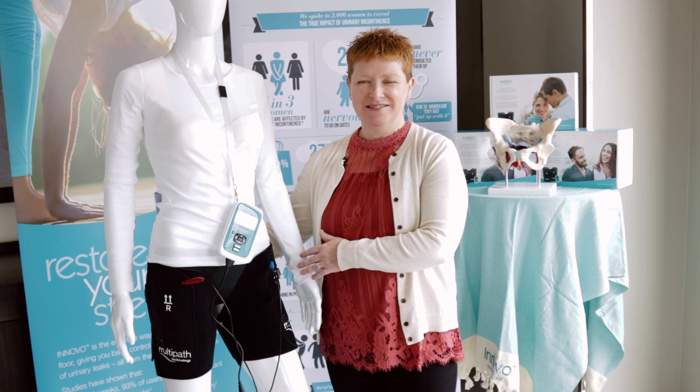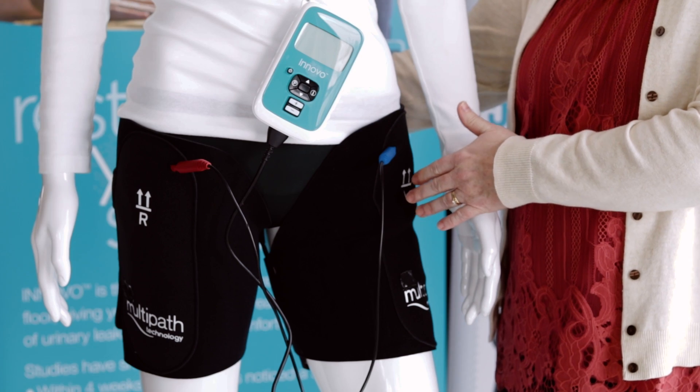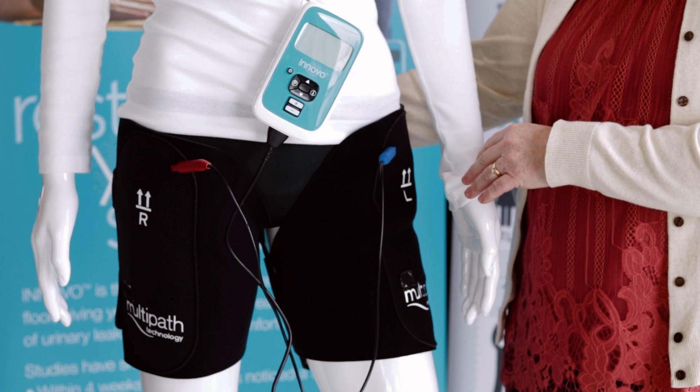This is the INNOVO therapy device. It comes with a controller and a pair of shorts. The shorts have eight electrodes embedded in them, four on the right and four on the left.